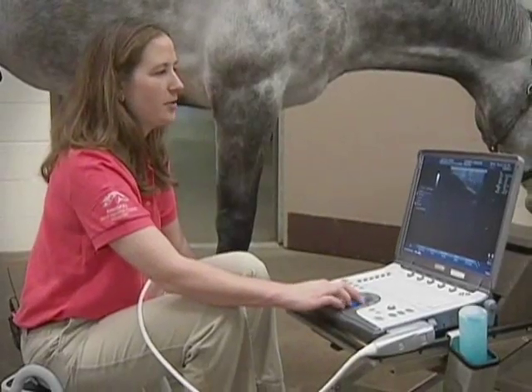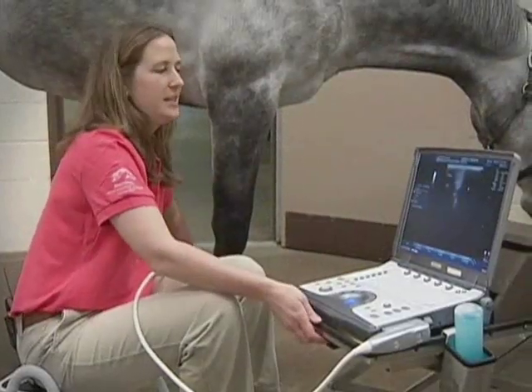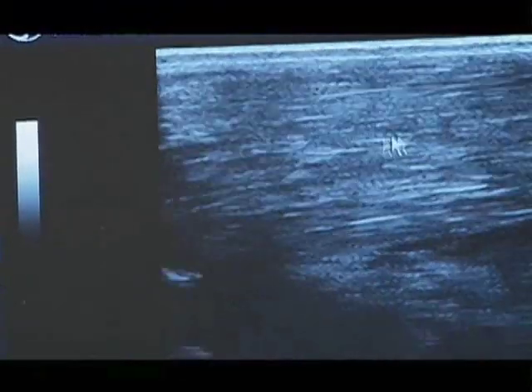You can see these nice parallel fibers right here — that's normal, that's what we'd like it to look like. But on his inside suspensory branch, he doesn't have those same nice parallel fibers. This is actually an area of abnormality. Those black areas are areas where his suspensory ligament has been torn.